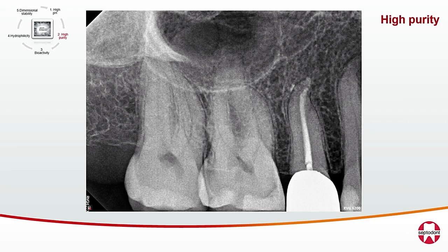I'm gonna show you my dirty laundry here. This is healthy bone, healthy PDL, and I did get a lovely little puff here. I was scouting this little apical area because I thought there was something extra going on down here. So I was scouting a lot. And as I scouted, I achieved patency in this lateral canal. And then I got a little ahead of myself and I gave myself a puff here.